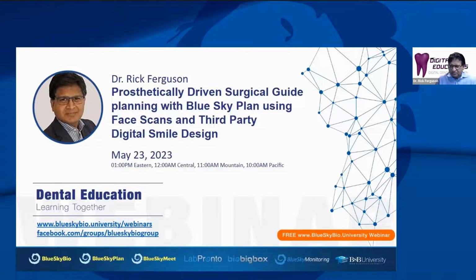The evolution of the software has just really been incredible, giving us the functionality to do a variety of different appliances and treatment modalities for our patients. It's an integral part of what we do in our clinical practice and what we teach.